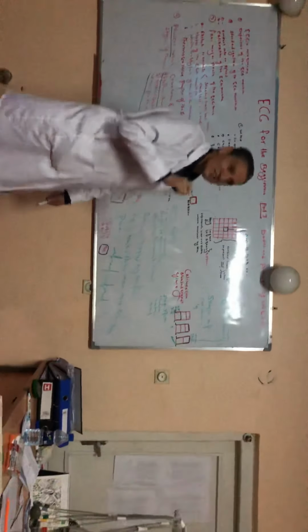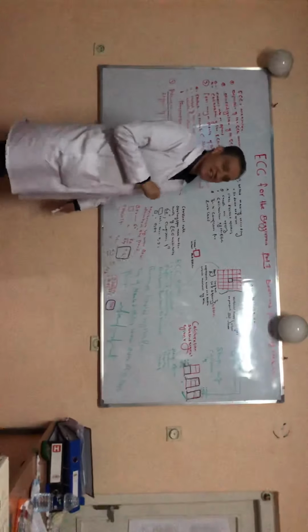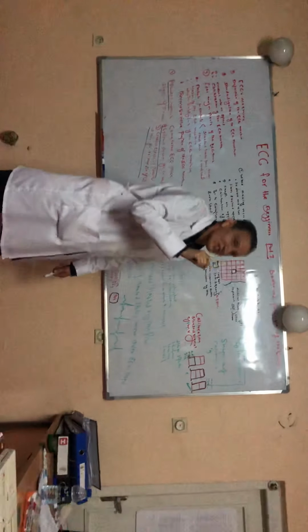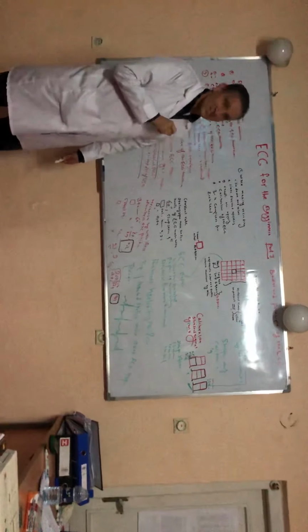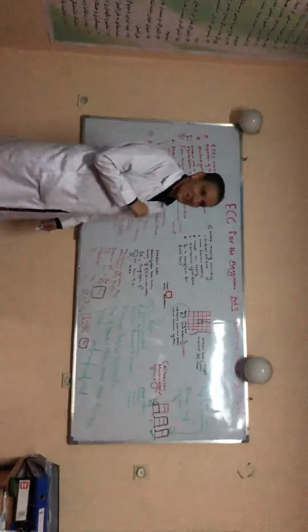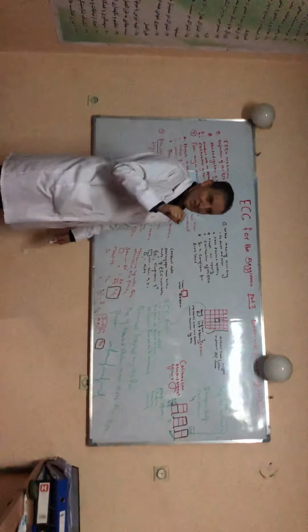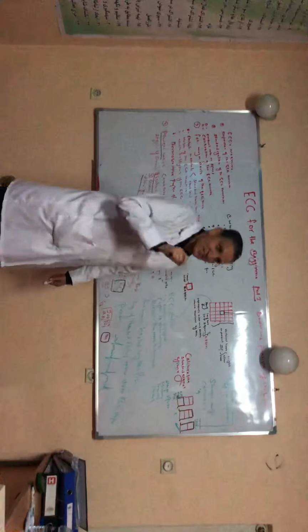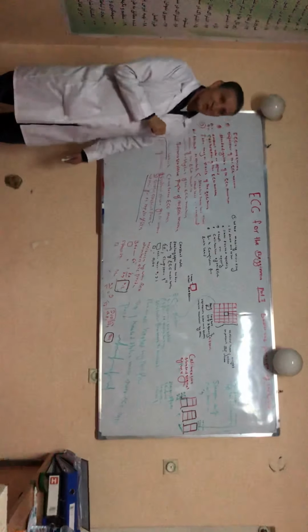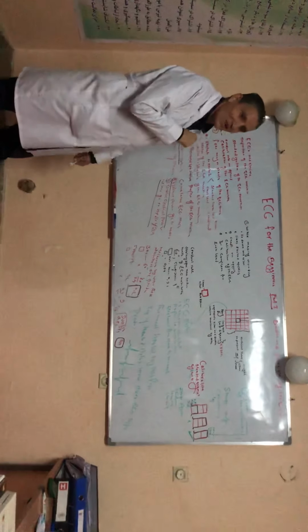Finally, 0.04 seconds. This 0.04 second represents the duration of the small box, which moves under the stylus of the ECG machine. How much time should be taken? It should take 0.04 seconds. Remember, I discussed this matter: the basic building unit of the ECG paper is the small square. All of the measurements that we do during the interpretation of the ECG, we should use 0.04 second. Right now we will discuss the mechanisms by which these numbers are produced.